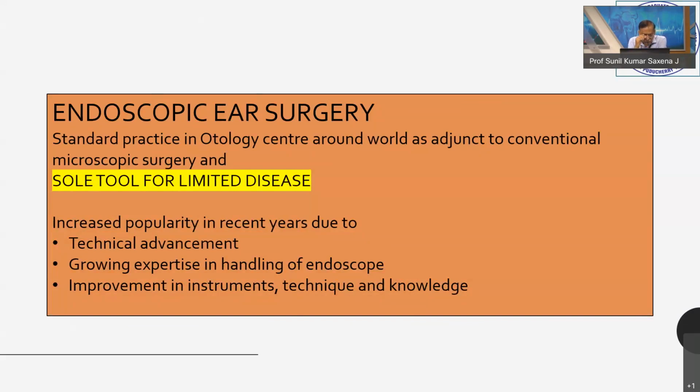Because of the increased popularity, a lot of researchers and clinicians have come. Researchers have refined the instruments, and clinicians have increased the knowledge and technique for endoscopic ear surgery. So the increased popularity in recent years is due to technical advancement, growing expertise in handling of endoscopes, and improvement in instruments, technique, and knowledge.